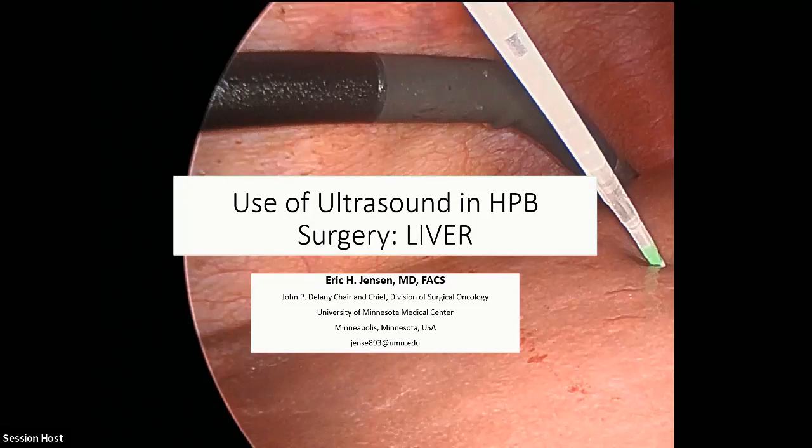Any pancreas and liver case that we do, automatically the ultrasound is on the cart. I might just recommend that everybody do that, because if you think to yourself during the case, I should ultrasound this, but then it's 20 minutes for someone to run around and get it, you're just not going to ask for it. But if the ultrasound is there waiting every case you do, it's very easy to say, let me do the ultrasound real quick and run the anatomy. So I would encourage everybody to have the ultrasound for any pancreas and liver case. To me, it's a good idea.